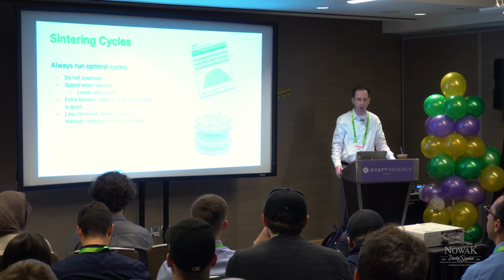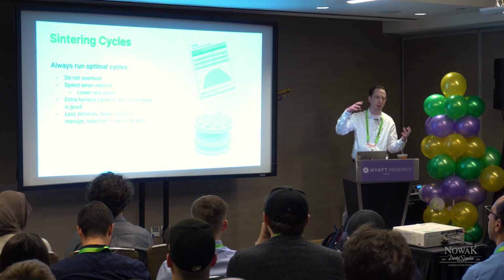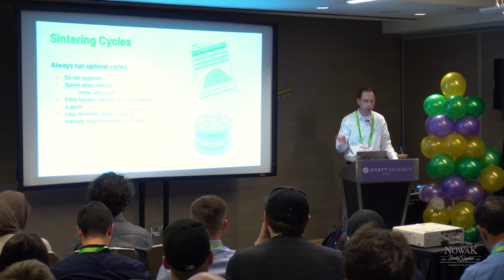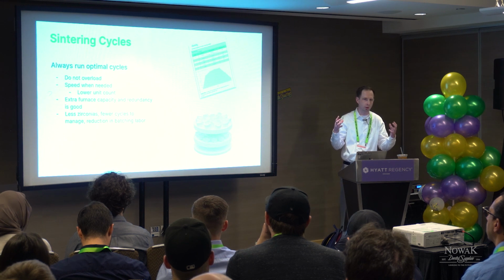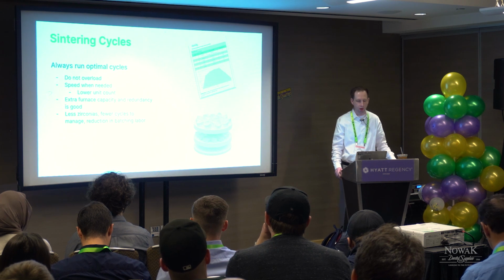And really keep your unit count down and try to keep your process as consistent as possible. So if you're stacking multiple trays, say you're doing 2 trays with lids, even if you're only doing 5 units, put the 2 trays in. That energy load, that mass, is really critical in having consistent firing and temperature ramps.